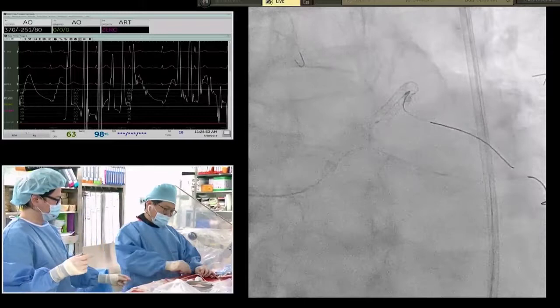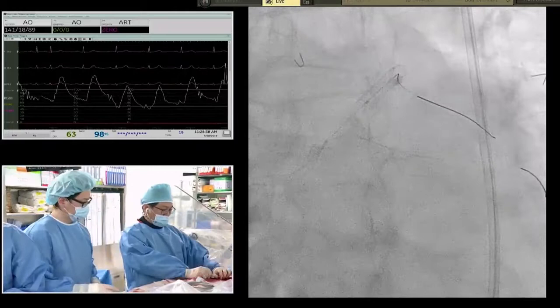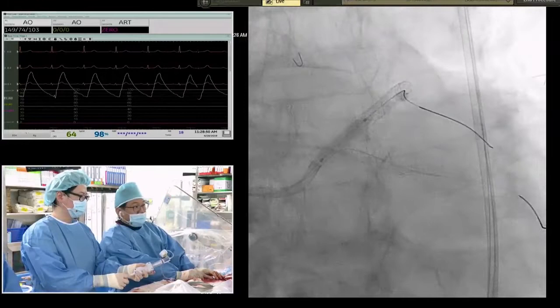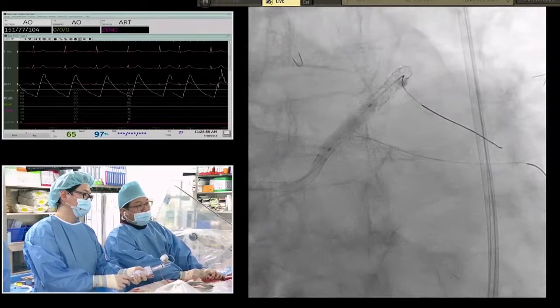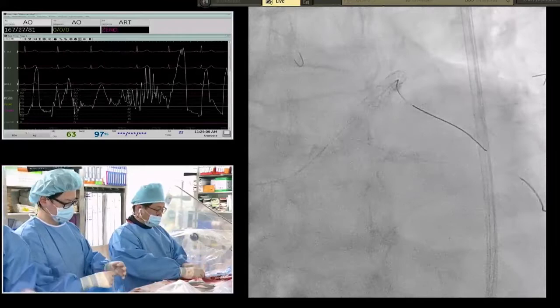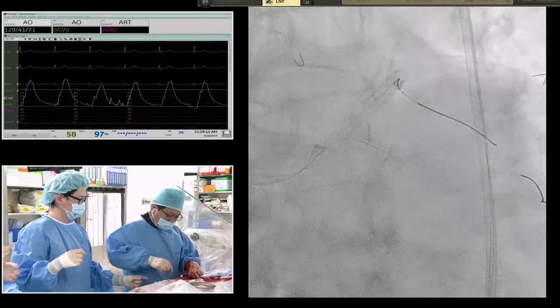Gary, one of the questions regarding DES for more than 10 years, neoatherosclerosis should be a lot. So if you're using OCT to see it, you might see some lipid-laden materials inside. DES for 13 years, Cypher. Do we just treat the left main plaque, or maybe we need to treat further down through the Cypher stent portion? Well, we didn't get a good look at the lumen within the Cypher stent. I would assume that whatever new intima there is is somewhat lipidic and has some elements of neoatherosclerosis.